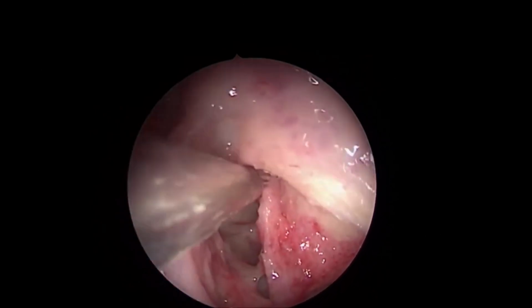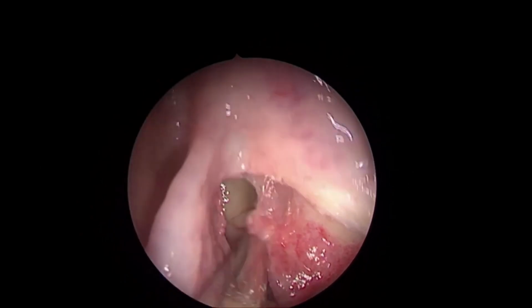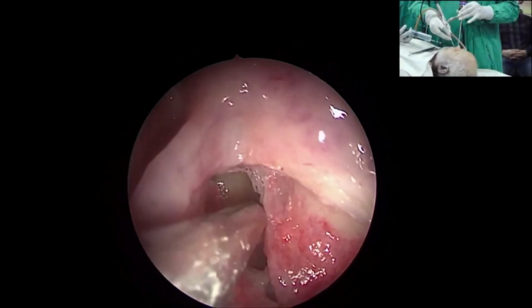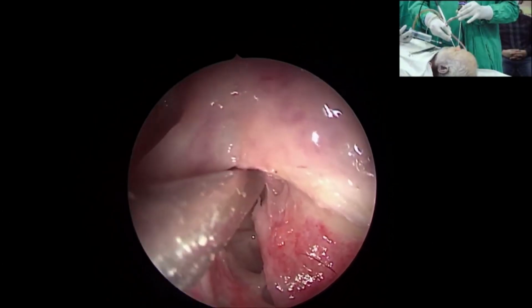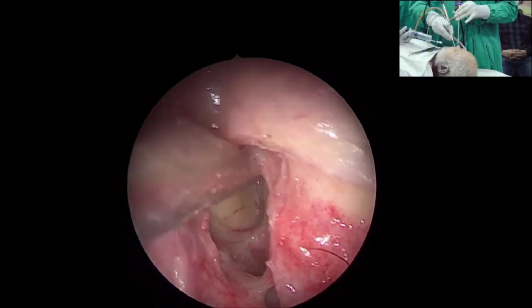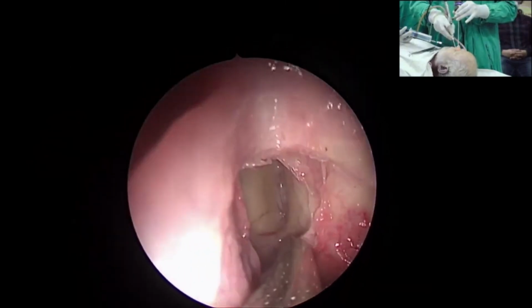You may find that my hands are so stable. It's not like my hands are stable on their own. I have stabilized them taking the help of the columella, where I parked my endoscope, and in the right hand I'm using my dissecting instrument, like the microdebrider this time.